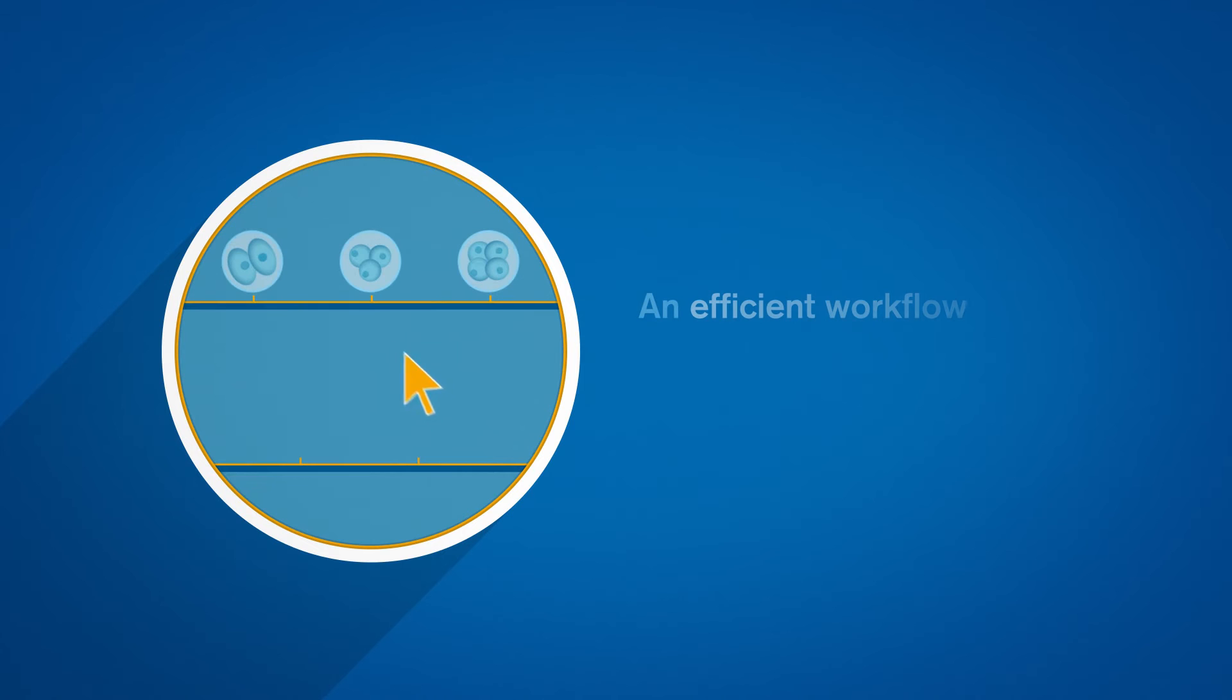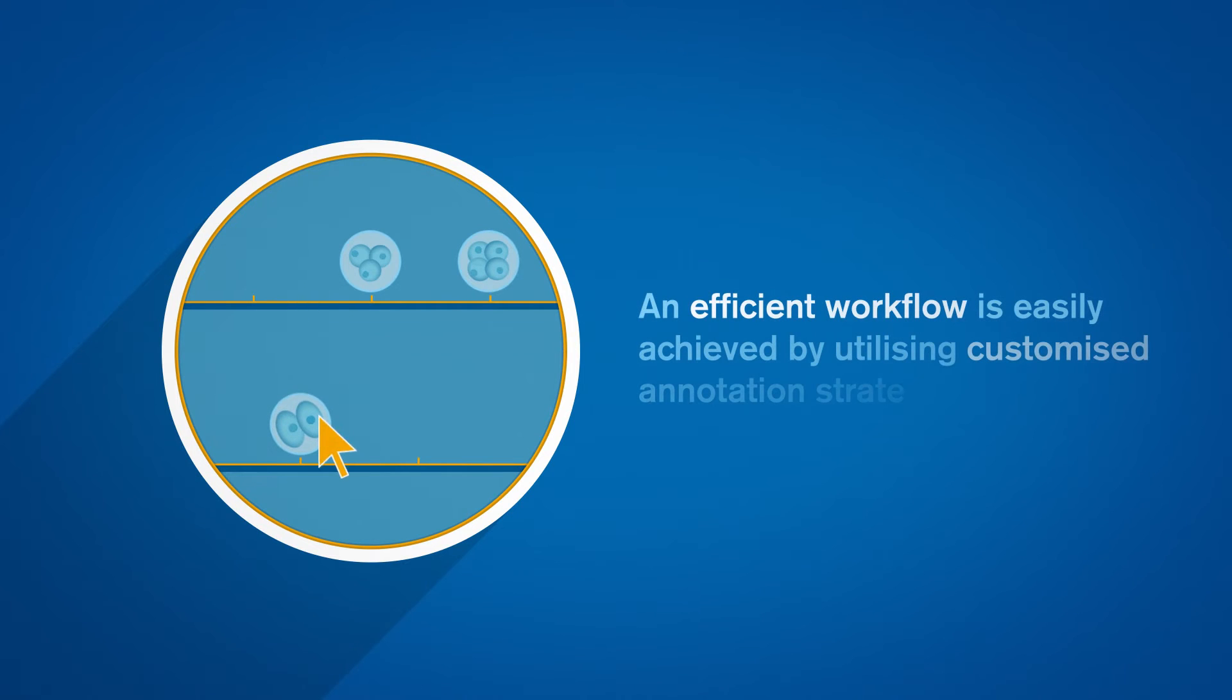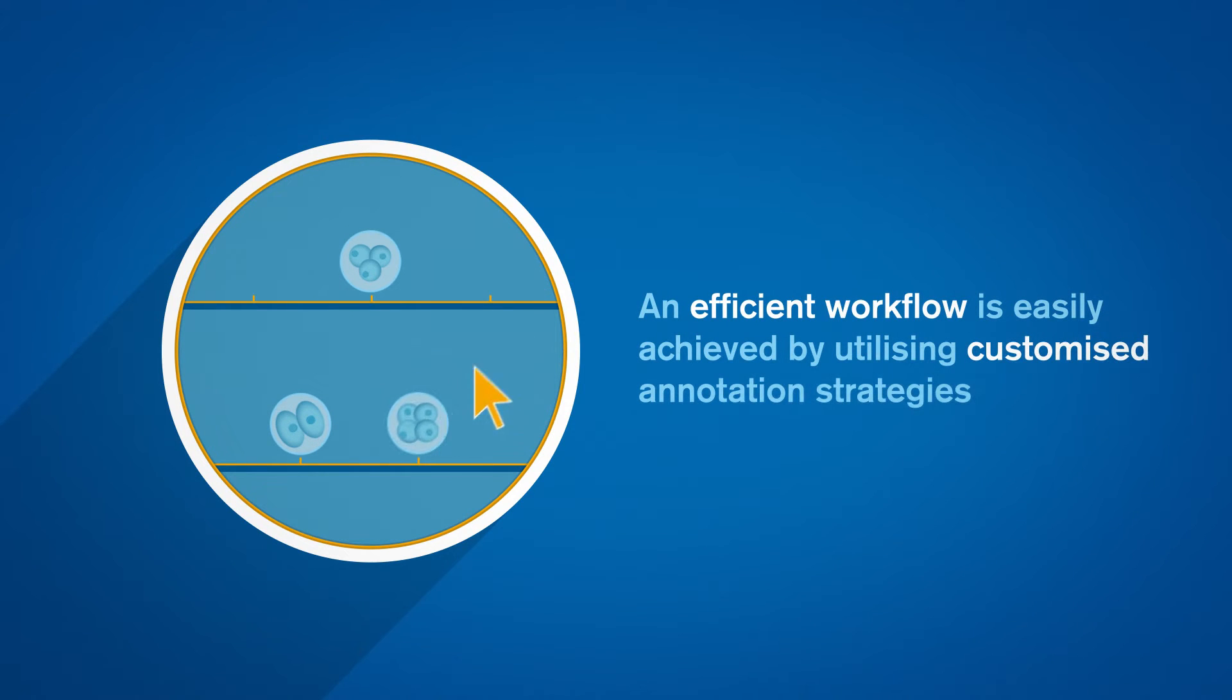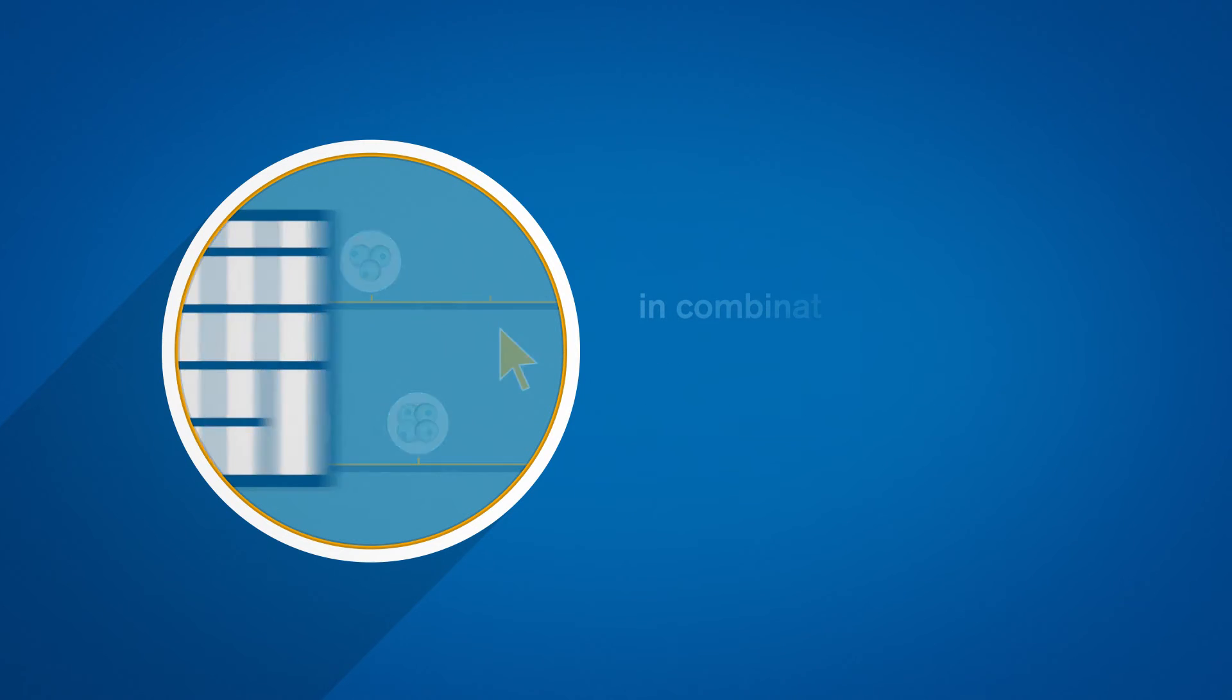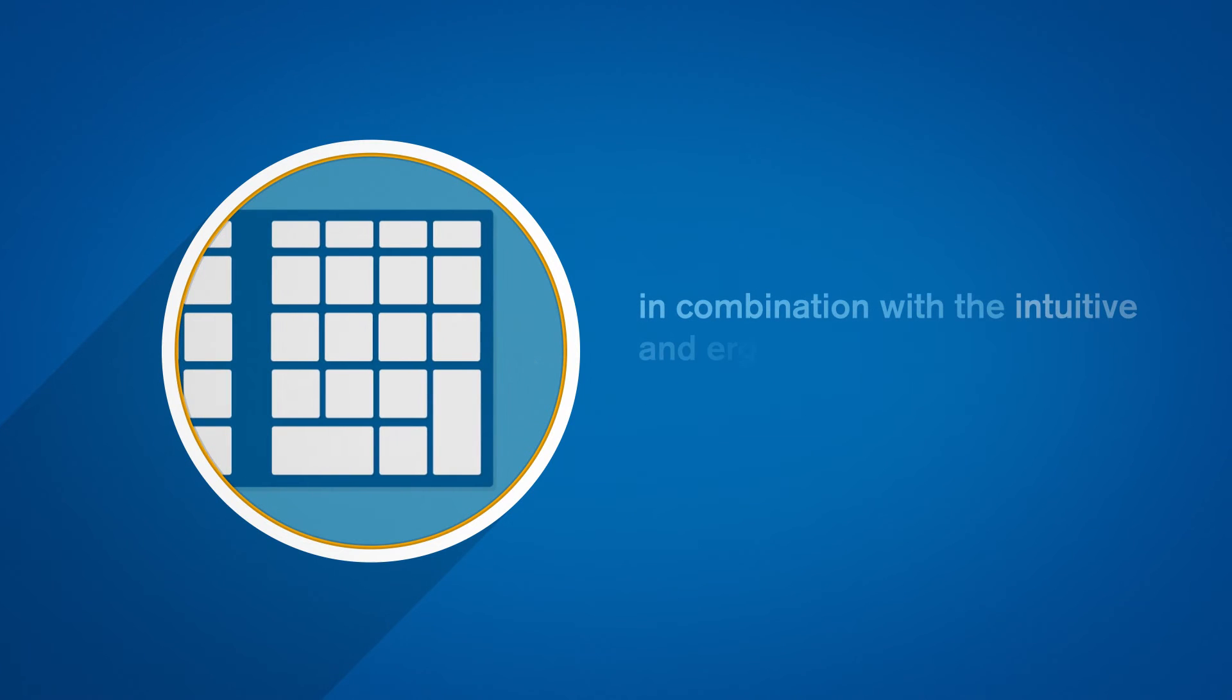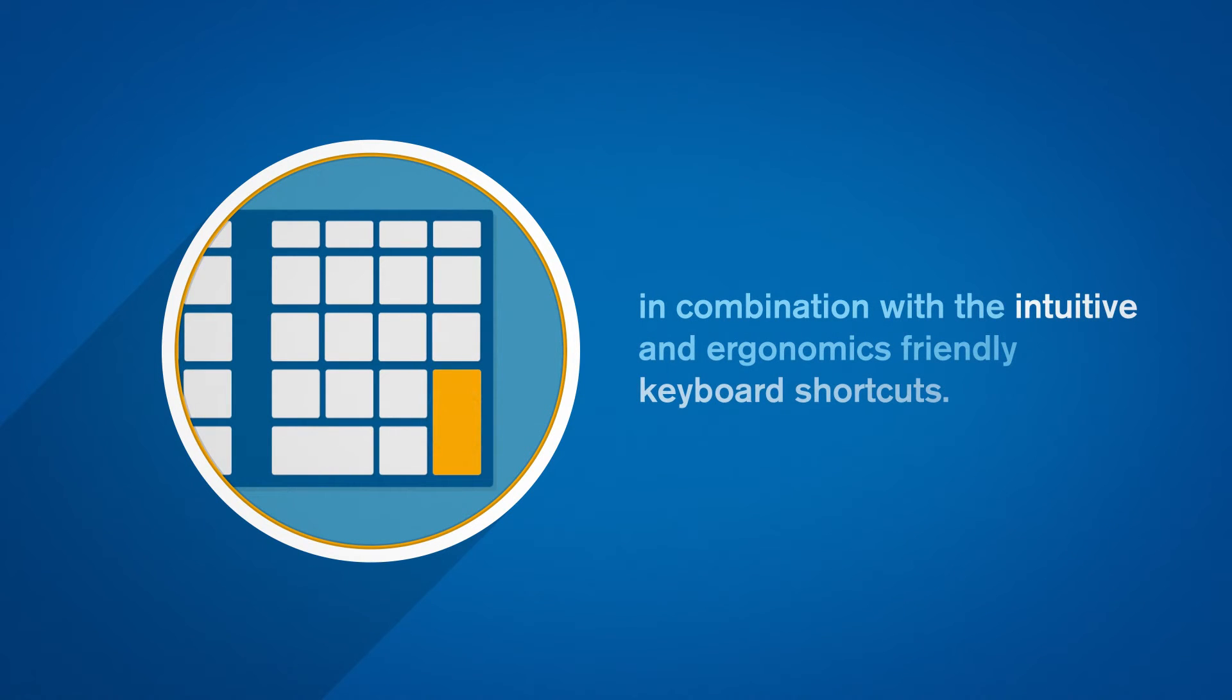An efficient workflow is easily achieved by utilizing customized annotation strategies in combination with the intuitive and ergonomics-friendly keyboard shortcuts.